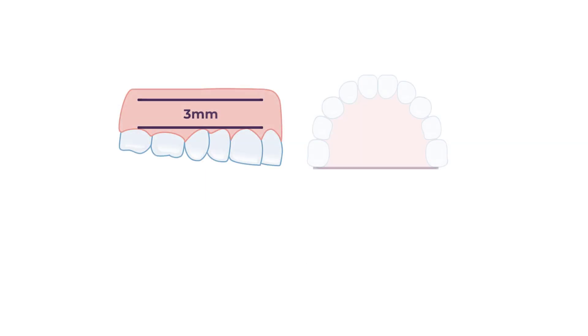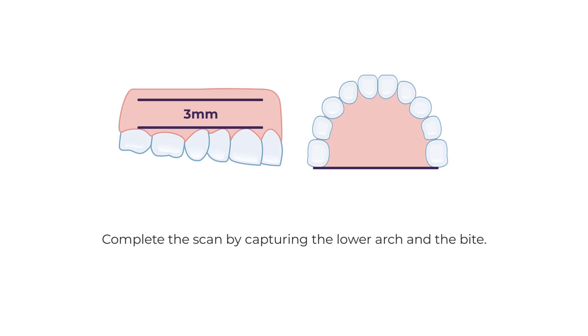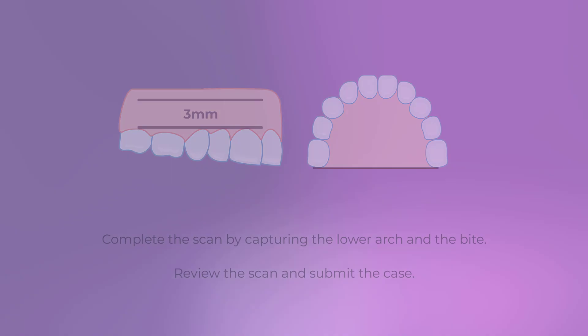After completing the upper arch scan with all the requirements, complete the scan by capturing the lower arch and the bite. Once you have completed scanning, review the scan and submit the case.